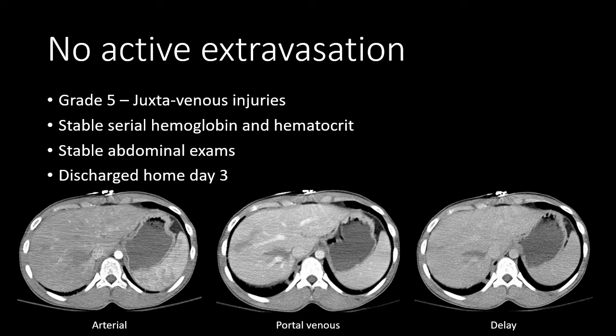Because of the central venous involvement extending to the IVC, this is a grade five liver injury. We do not see any active extravasation. The patient was managed non-operatively, did not require embolization or angiography, had a stable hemoglobin and hematocrit, and stable abdominal examinations — and was actually discharged home without any operative or interventional radiology management.